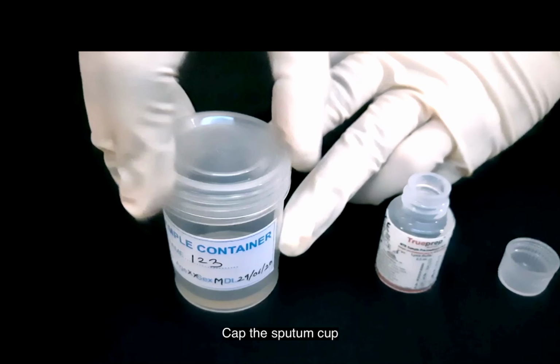You can just close this lysis buffer and leave it even at room temperature, away from sunlight, for up to 1 week, and the DNA will be intact in it. There is no problem with that. So up to this stage there is no issue.